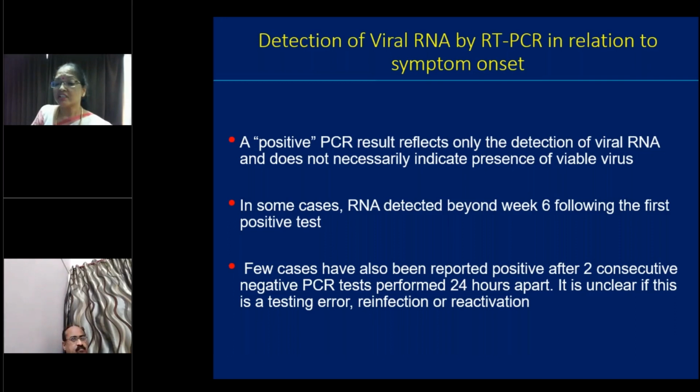So a positive PCR result reflects only the detection. It is important to understand that it reflects only the detection of viral RNA and does not necessarily indicate the presence of viable virus, because it will detect both live and dead. And in some cases, as I told you, it usually decreases after 2 weeks. But in some cases, RNA is detected beyond 6 weeks following the first positive test. So it varies from case to case.